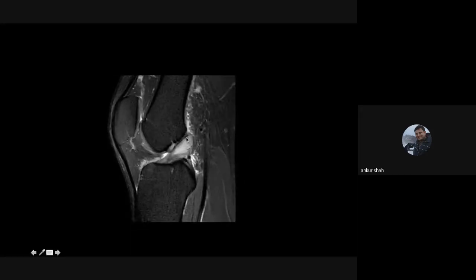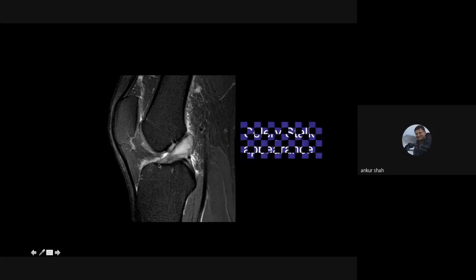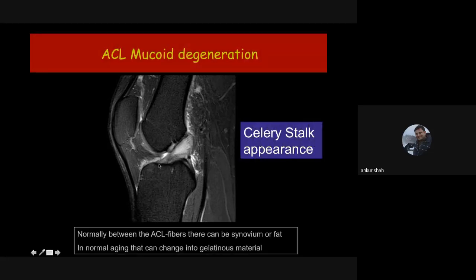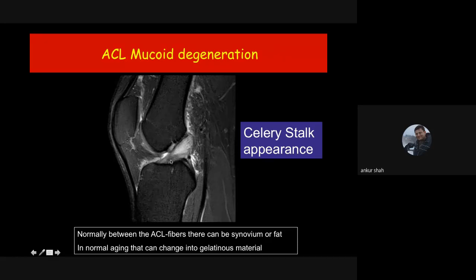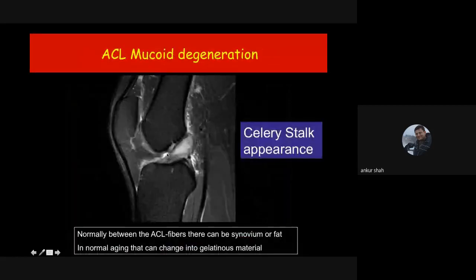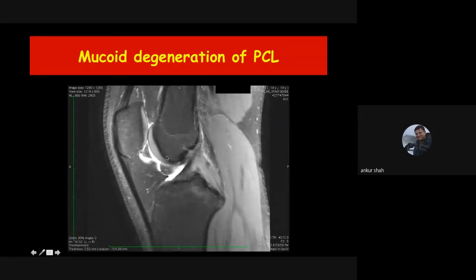When you see an enlarged ACL with multiple fluid locules in its fibers, this is the celery stalk appearance, classical of mucoid degeneration of the ACL. The ligament is not torn — only swollen with fluid locules. It can be associated with adjacent cyst formation. Mucoid degeneration of the ACL occurs in patients without trauma, seen more in elderly individuals with degenerative changes, but increasingly seen in young individuals as well, causing significant pain particularly during flexion.